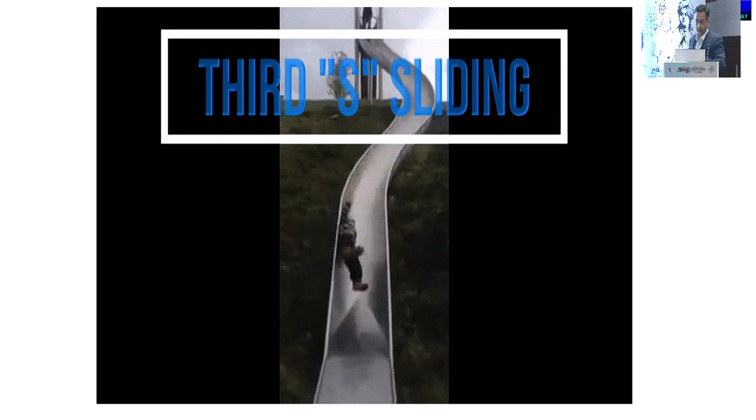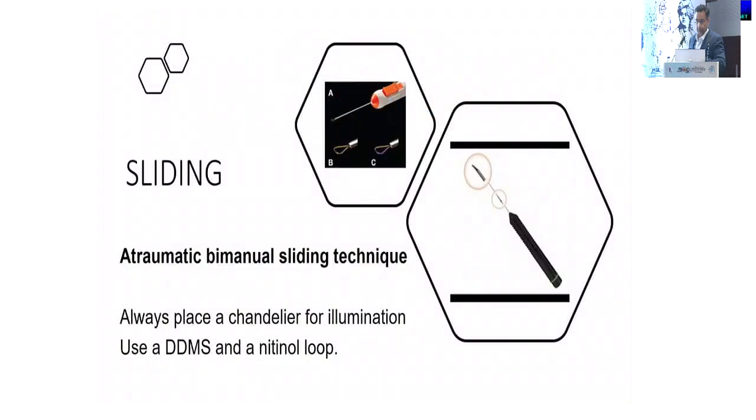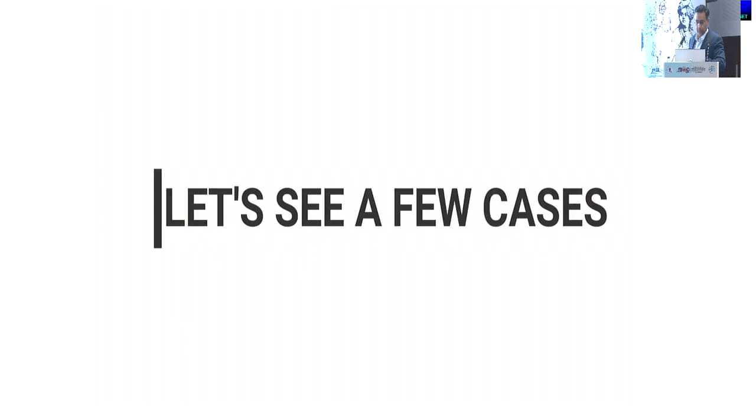Third S, sliding. Accurately and atraumatically placing the HAM graft is a major challenge. We use a bimanual sliding technique with a Tano brush and a nitinol flexible loop. Let's see a few cases.